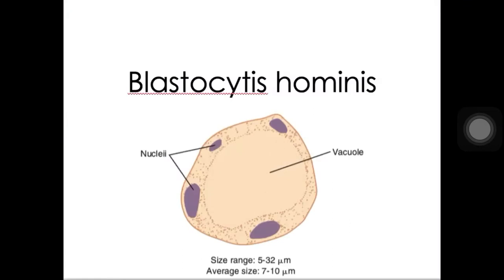Actually, the taxonomy of your Blastocystis hominis is still unresolved because it was classified originally as a yeast but now regarded as an amoeba. Okay? And actually, polymorphic po itong organism na to. It is existing in many forms. It can be an amoeboid, a granular, cyst form. Pero yung pinaka-common na form niya yung central body form or central vacuolar form. As what we can see here, ito po yung kanyang vacuolar form. So, yan po yung commonly identified na form niya.